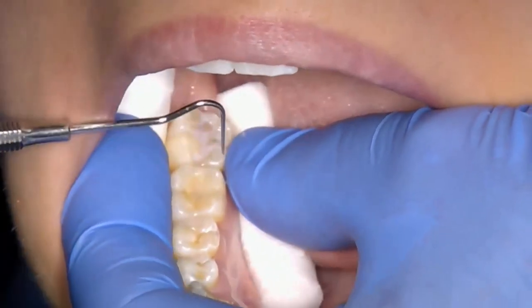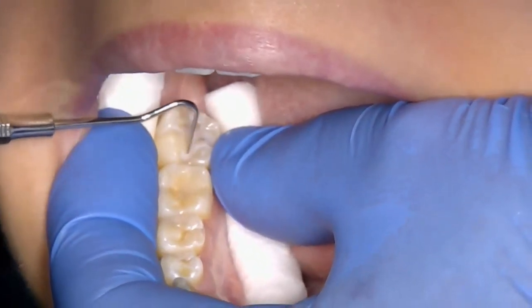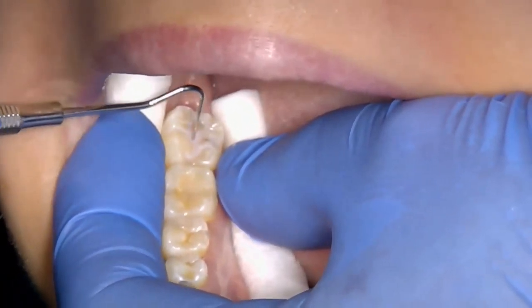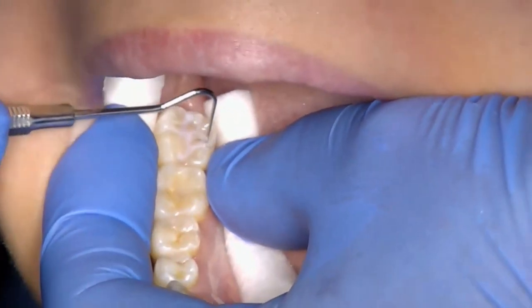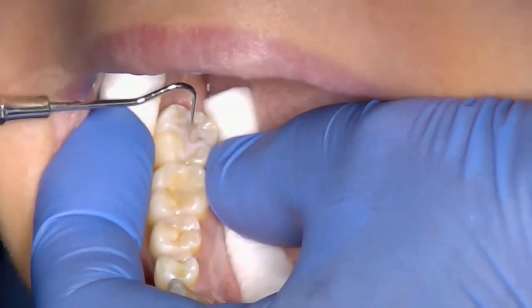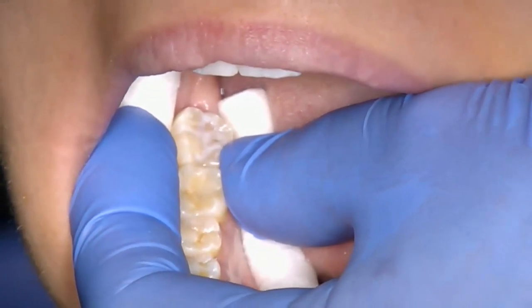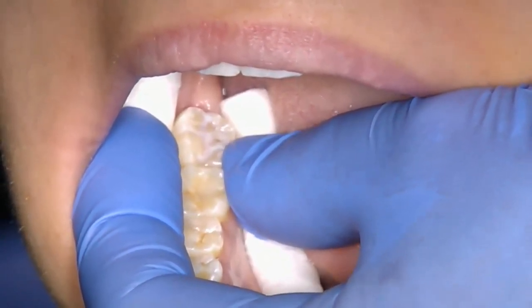Light cure the fissure sealant as before. Using a probe, firmly run the tip round the margins of the fissure sealant to ensure that it is correctly bonded. If the fissure sealant lifts, fractures, or is removed at this stage, the whole procedure needs to be repeated.